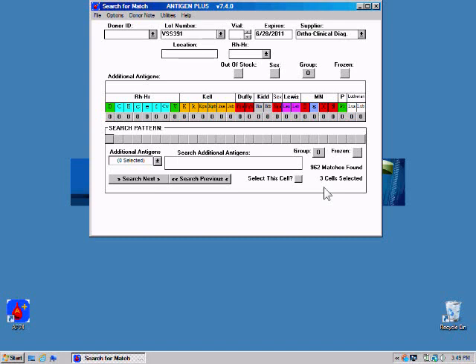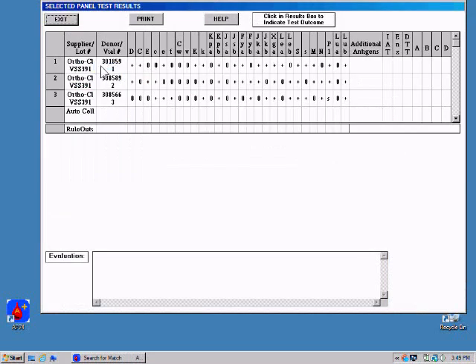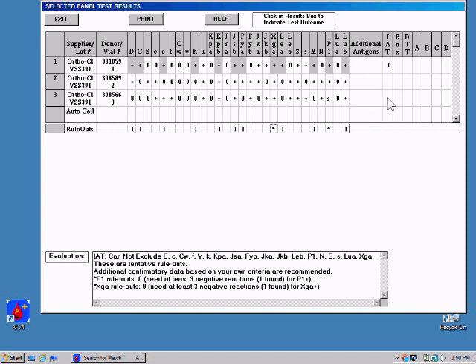When you have your test results, drop the File menu and go to the Results panel. Enter your results in the appropriate column. In our case, we did an antiglobulin test, so we'll put the results in the indirect antiglobulin test column. Click in the open square, and the test results appear to the left. In this case, cells 1 and 3 were negative, but cell 2 was a clean 3+. As in most situations, at this point we did not run an autocontrol, so we'll leave that blank.